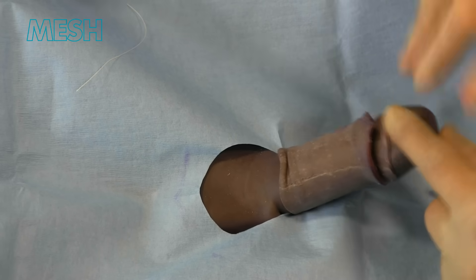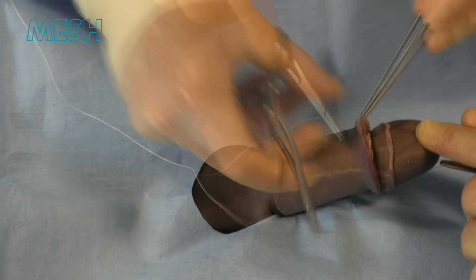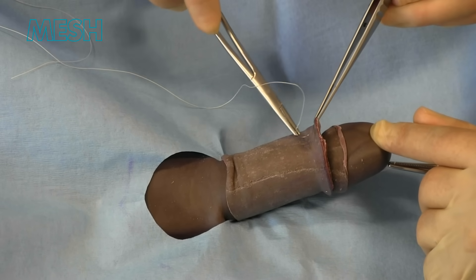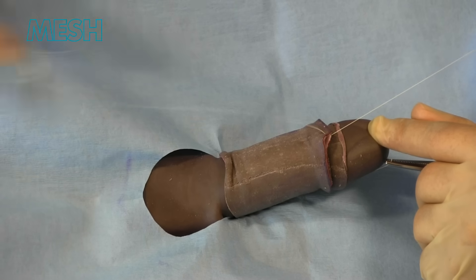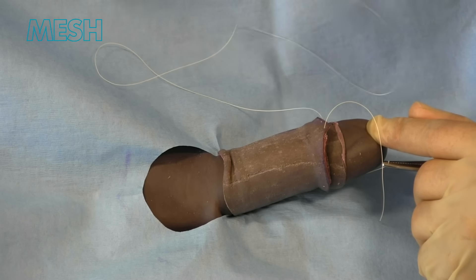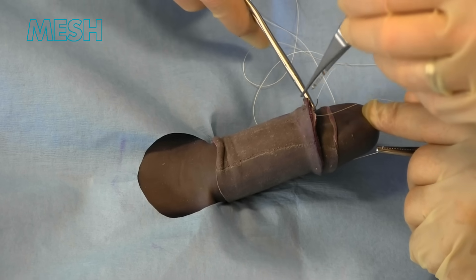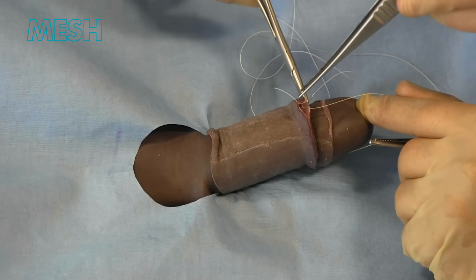The penis is angled cranially to allow your frenular suture. This is performed as what we call a box suture, where the initial bite is taken on the lower aspect, sutured onto the inner incision line, and the needle is then turned to make a C shape. The inner incision line is picked up followed by the outer skin. This is then tied and again left long to allow a clip to be placed to aid with further sutures.